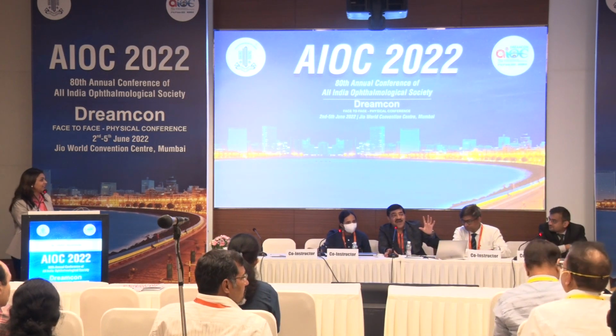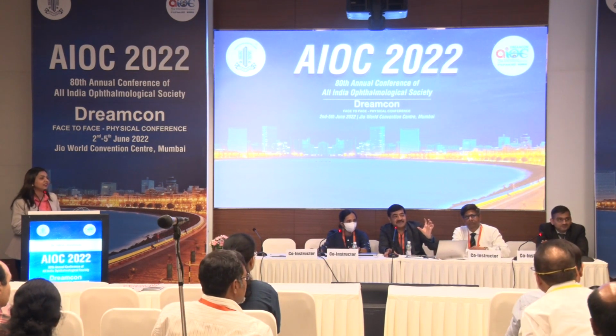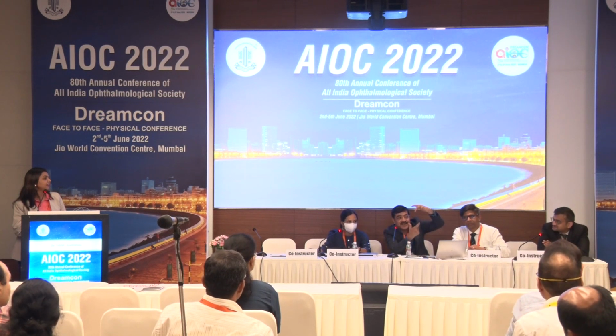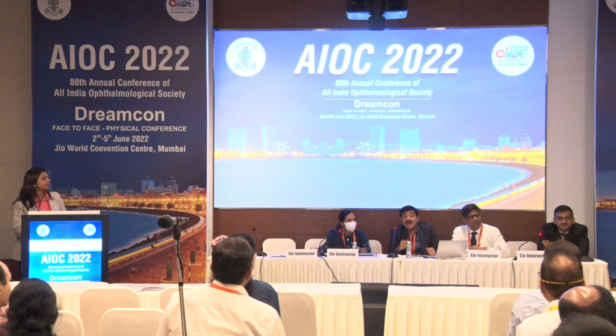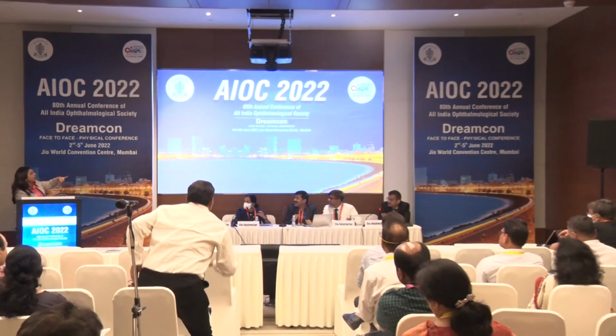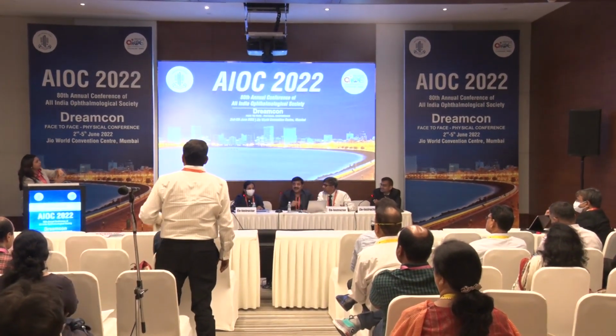I just thought, practically, it's very difficult to get the picture of the corneal photo. The only problem is keeping the hand steady. So can it be mounted on a slit lamp or some sort of device and ask the patient to look? But you have to take it really close, so you can't mount it on a device. You can just put one finger on the forehead of the patient and stabilize the hand. Finger, right.